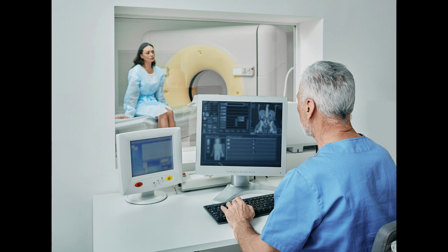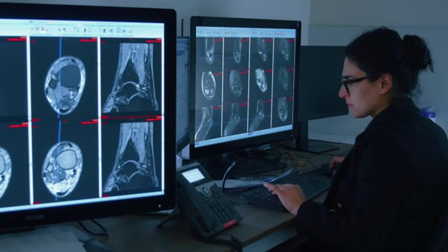Here, the technologist also selects the grid, filters, and even sends the image to PACS. The operator's technical experience in the control room helps reduce repeated errors, choose the proper technique, and consequently lower patient dose while improving image quality.